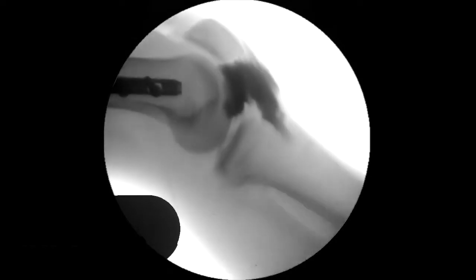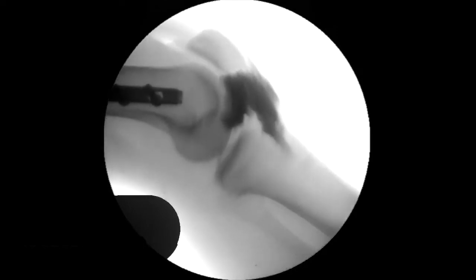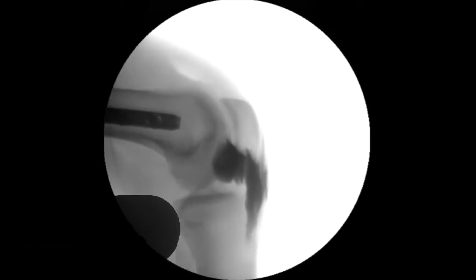After IPP release, in flexion, the detethered fat pad occupies the notch, and as the knee moves, opposes the curves of the distal femur with little distortion. Pain relief may be mechanical, eliminating irritation of the nerves, or from altering severed neural pathways.